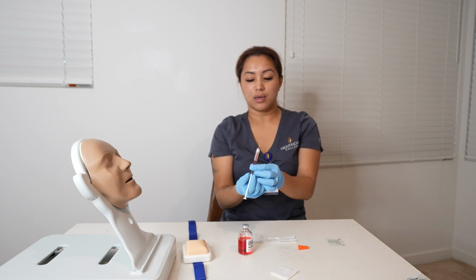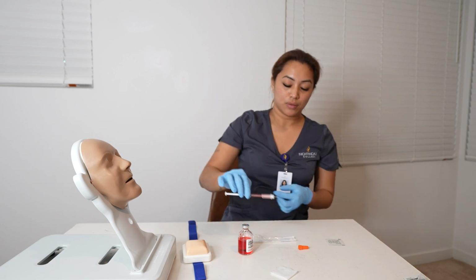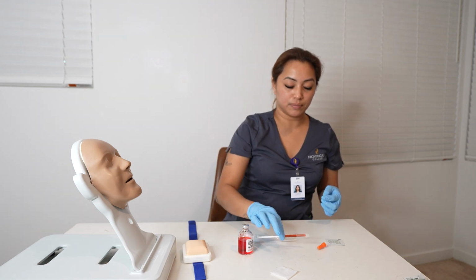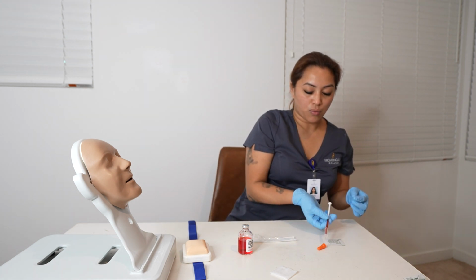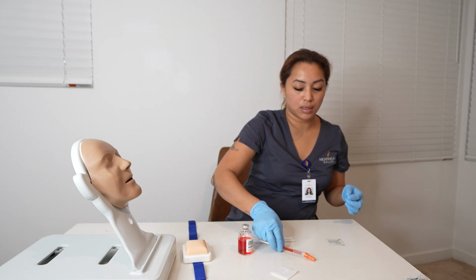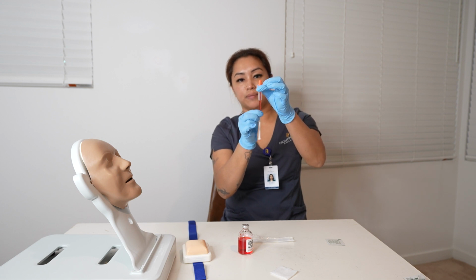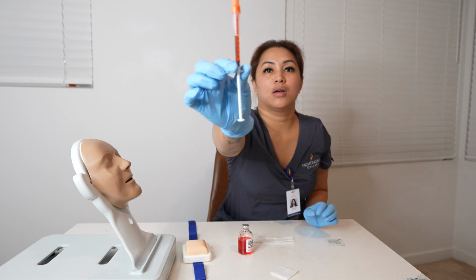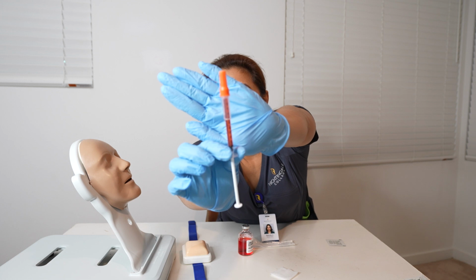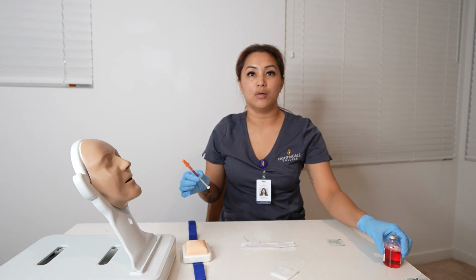Now that we have no air bubbles, we are going to do the one scoop method. Alrighty, and now we are going to cap it. So this is 1 ml. Alright, perfect. Now that we have the 1 ml, put that away.